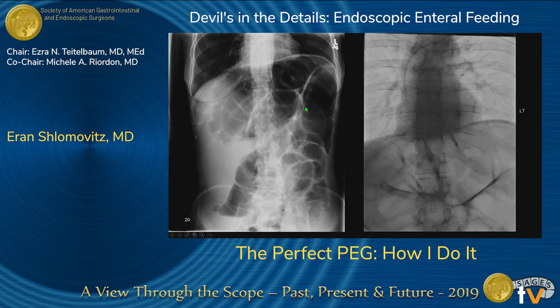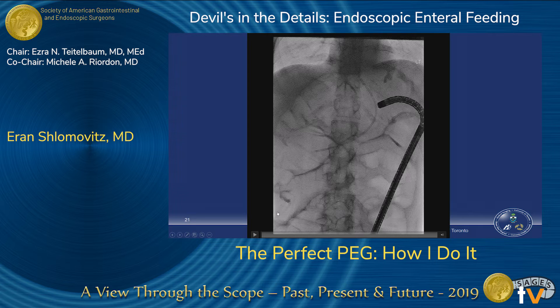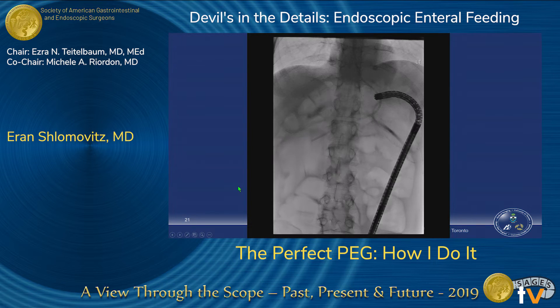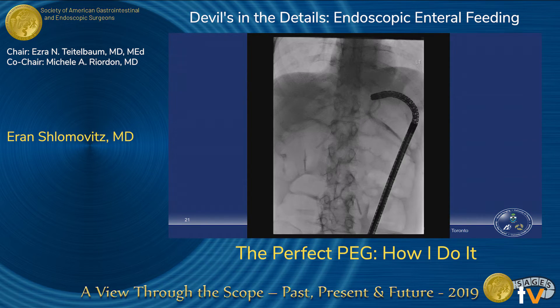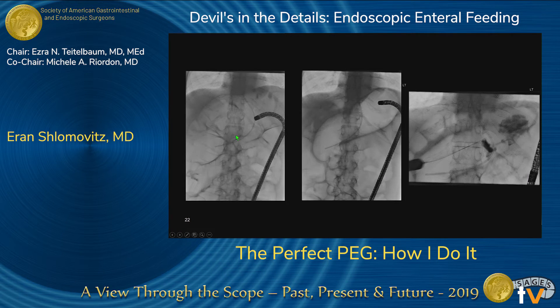Here's a patient with a chronic motility issue — he's not obstructed, but this is what he looks like usually. The transverse colon is hiding the whole left upper quadrant. What we did was get a flex sig up to the transverse colon and manually decompressed him, sucking out the whole transverse colon. Once sucked out, we inflated the stomach, giving nice easy access to put in a PEG tube. That's a useful endoscopic option in some patients.